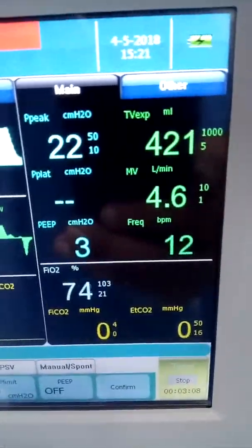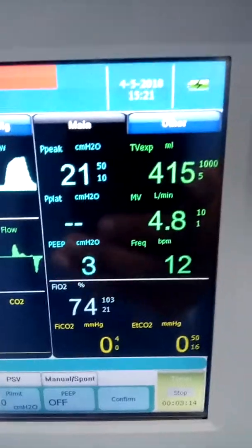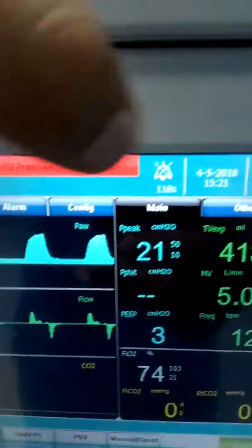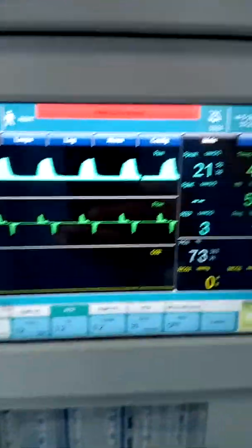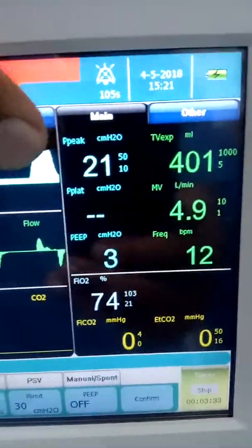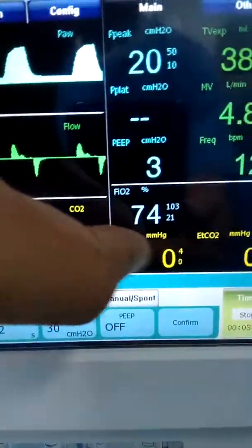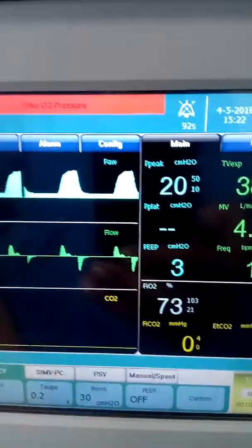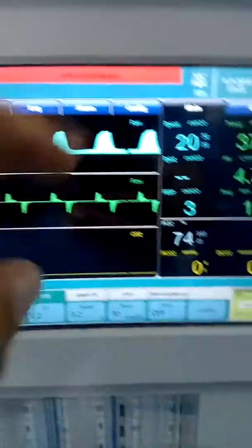These are the monitoring parameters. I have muted the alarm. On the ventilator display you can see peak pressure, plateau pressure, PEEP, FIO2, FICO2, and ETCO2. The ETCO2 parameters and waveform are optional — they appear if you have the ETCO2 module installed in the machine.